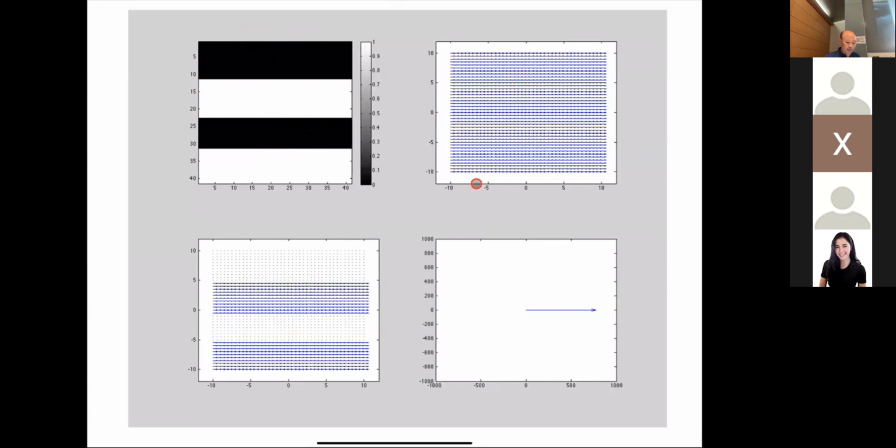This is the orientation of the spins, and you'll see there's a spin everywhere. So this is essentially the spatial pattern that the gradients want to create, okay? And then this times this is this. So this is the spin pattern imposed on my object. Where there's no spins, it's just 0. And the multiplication is just done because there's no spin there. So there's nothing there.